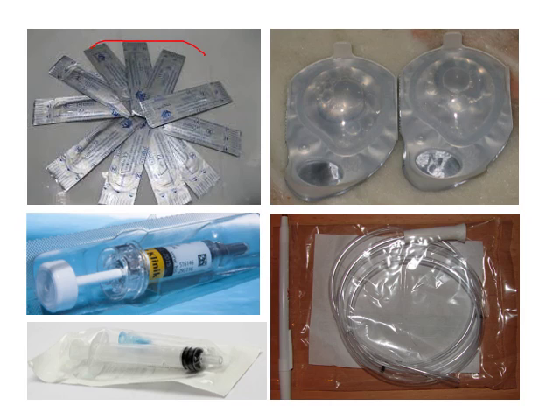And this is an example of the different types of packaging available. These are disposable scalpel blades in a foil wrap packaging, and there's a little opening here, so you can see these arrows are where you open the foil wrap. These are contact lenses in a blister pack, so it's a foil underside and then a clear plastic top layer. You can see the seal, which I've marked by an arrow, sealing in the contact lens, which is in fluid.